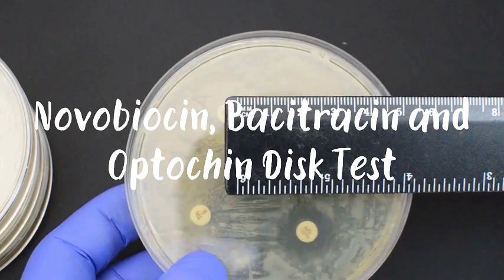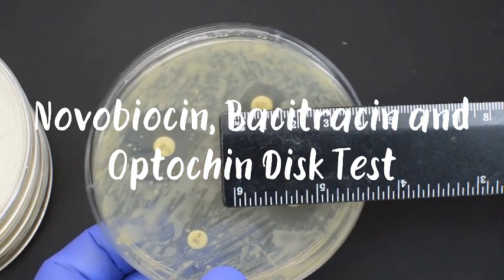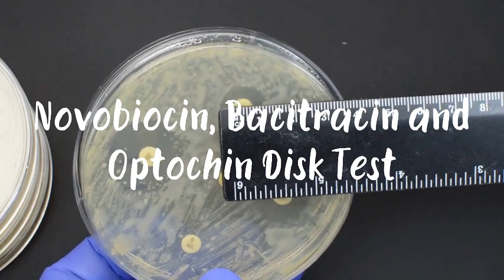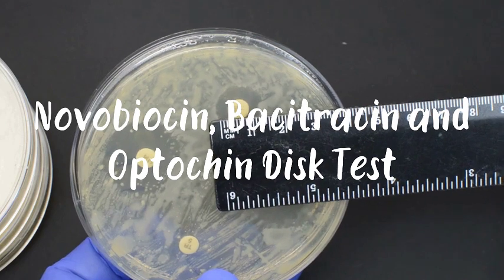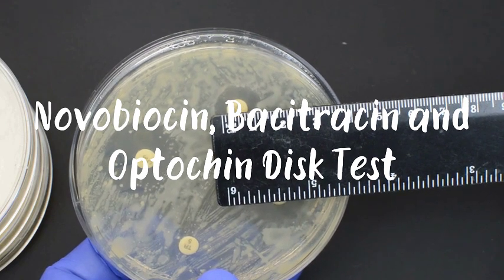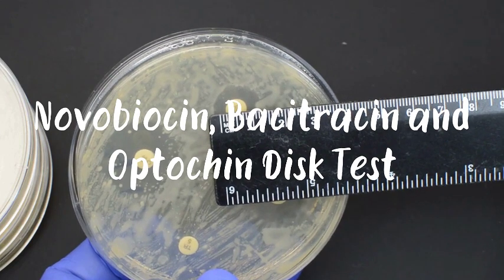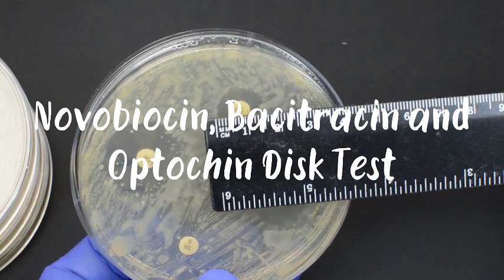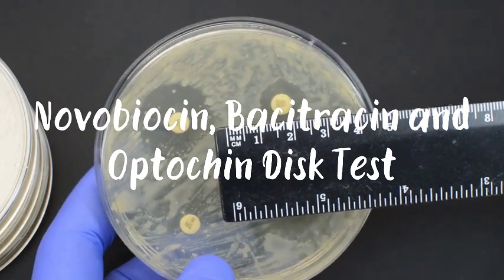For the novobiocin disc, we are going to detect Staphylococcus epidermidis and Staphylococcus saprophyticus, wherein Staphylococcus epidermidis will be susceptible to novobiocin, while Staphylococcus saprophyticus will be resistant to novobiocin.